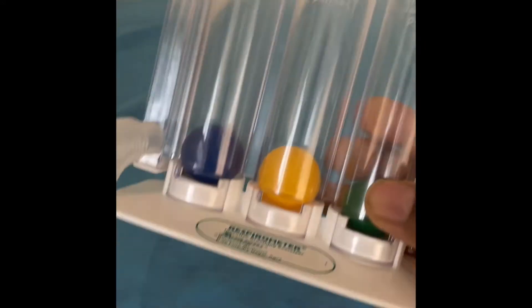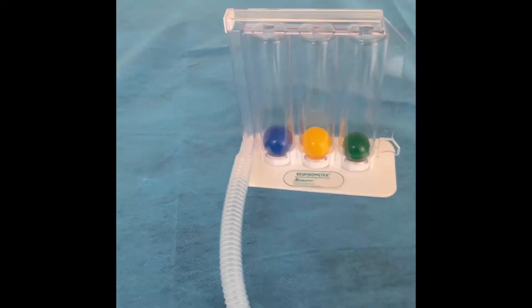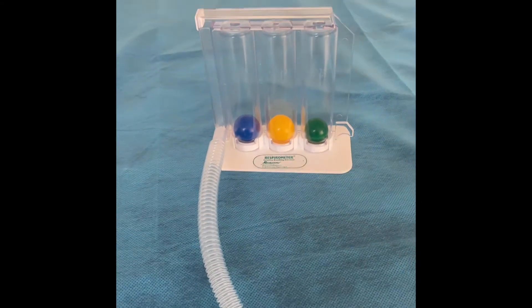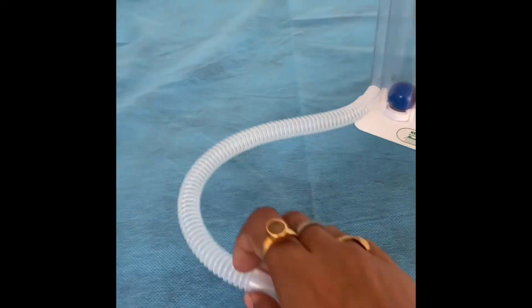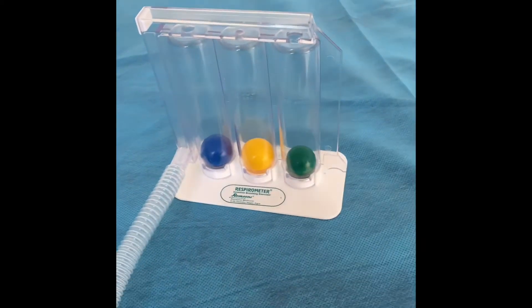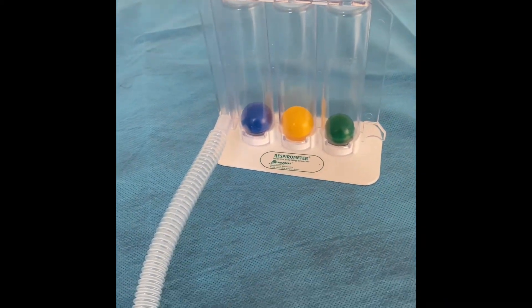So this is one way — you have to inhale, and then you can hold the ball for the maximum number of seconds. In my case, as you have seen, I can hold it only for a very minimal number of seconds, and only once did I reach the third ball.